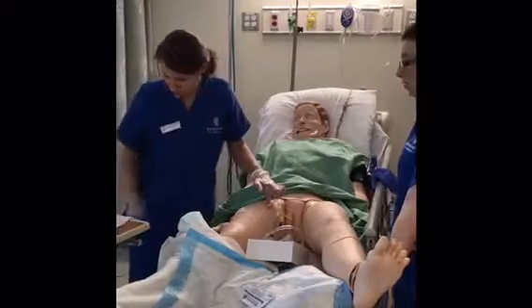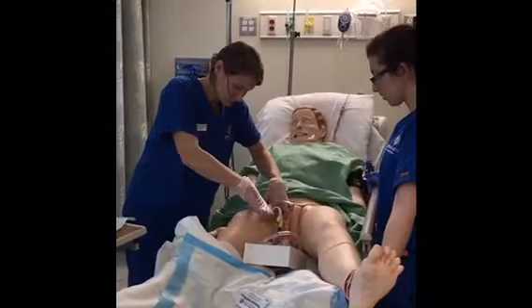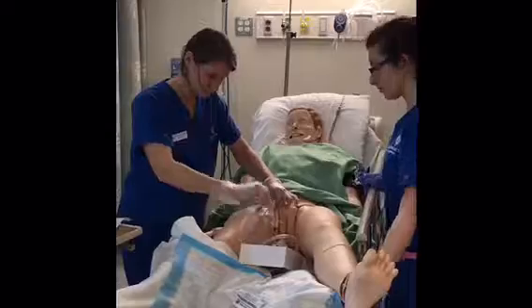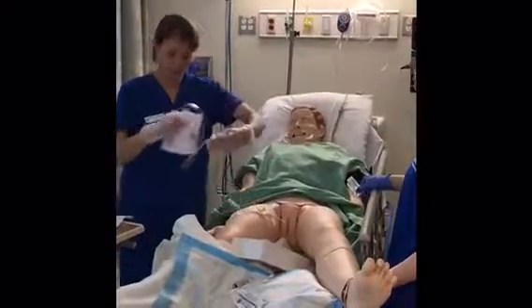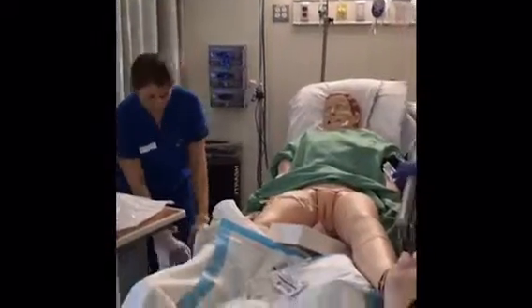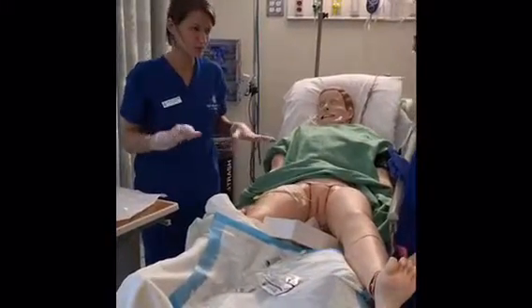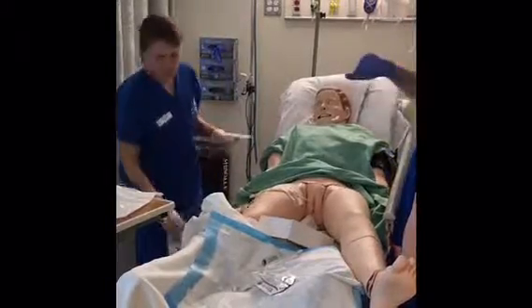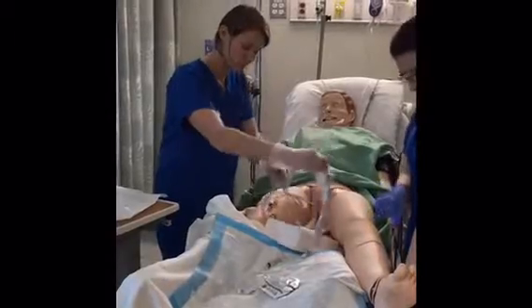And then I'm going to tape it to my patient's legs, making sure that there's enough give without pulling, and I'm going to put the bag below the bladder on the side of the bed, not the railing. And then I would clean up my mess, do hand hygiene, document my findings, document how the patient responded, and now I'm going to show you how to remove the catheter.